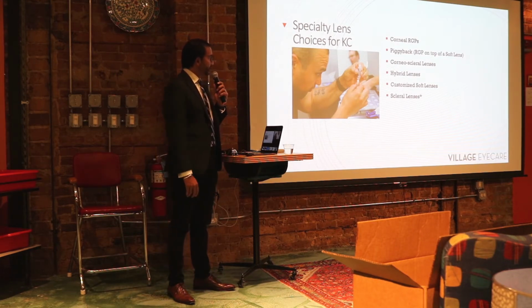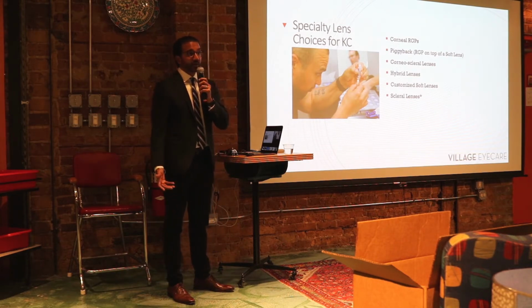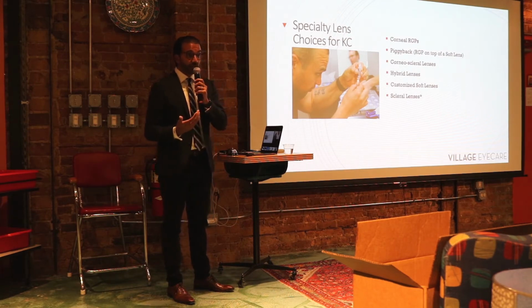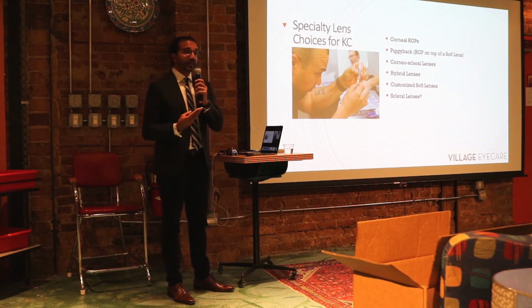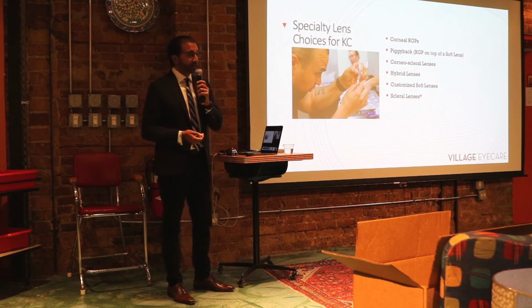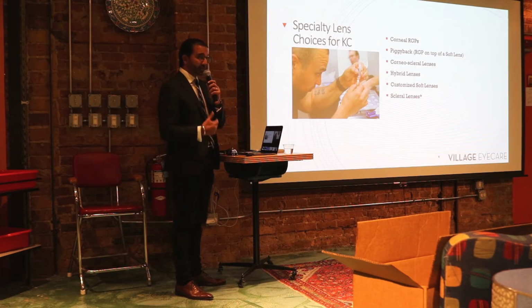Which brings us to scleral lenses. Scleral lenses, I find, give us the trifecta we look for in all contexts. One that is healthy for the corneal tissue, one that is comfortable for the patient to wear, and one that allows one to maximize vision restoration. And tonight, because of the success we've had with scleral lenses, I want to focus my talk on this modality.